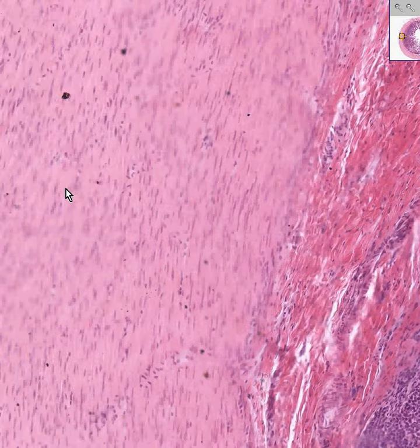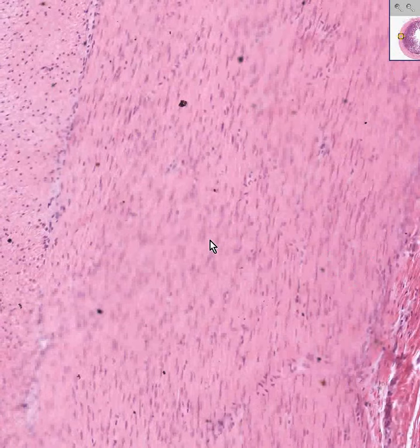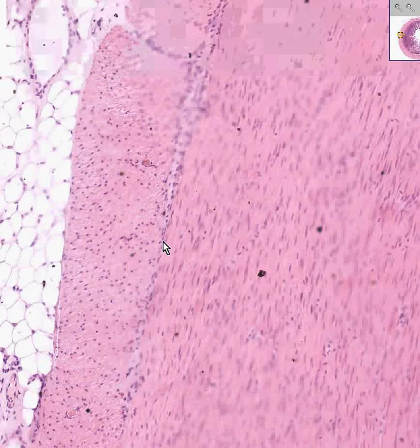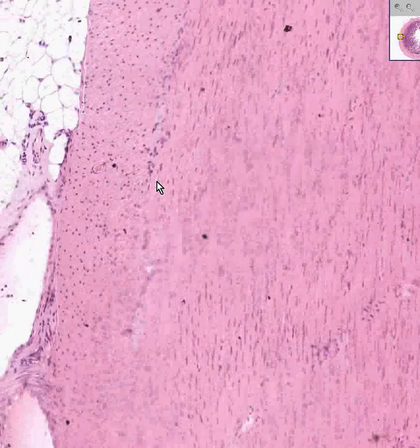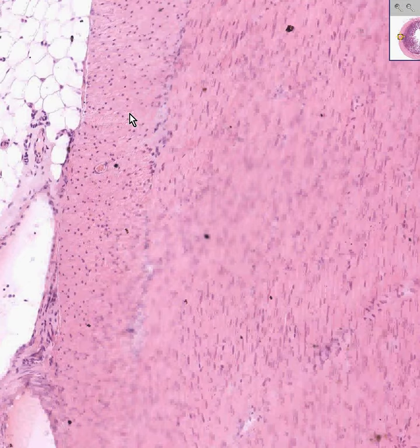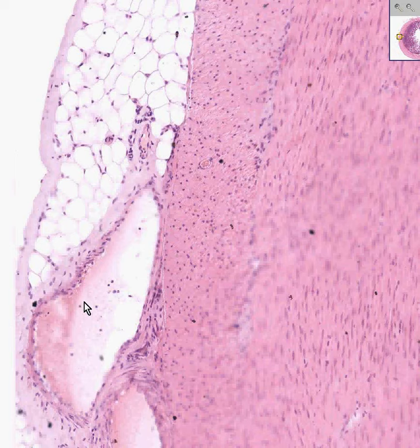You know these are circular fibers because they are spindly when we cut the intestine transversely to the axis, and you know these are longitudinal outer fibers. Occasionally you'll see little connections of neural or ganglion-looking cells between the longitudinal and circular layers, which represent the myenteric plexus. Notice we have some connective tissue of the serosa, blood vessel, artery, vein, fat, and connective tissue.